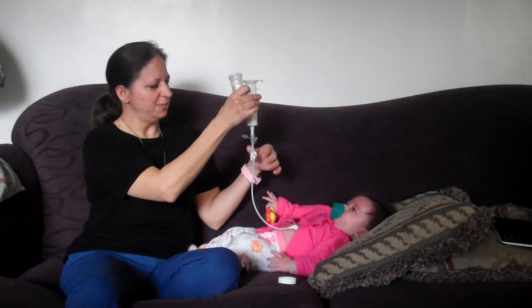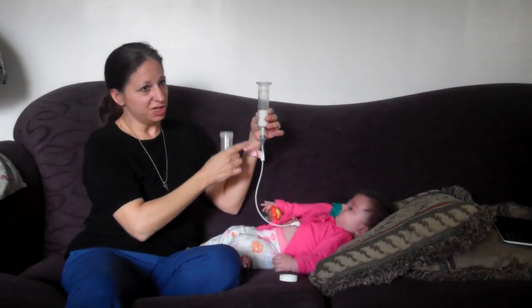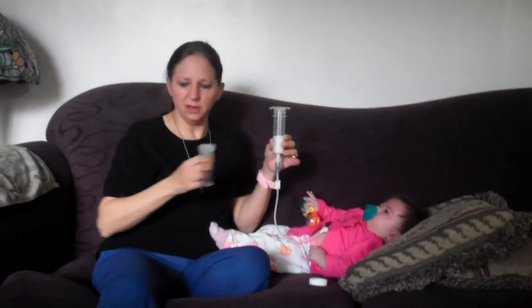See, now she's pushing it back up. She can push it all the way back to the top. So I'm going to clamp it for just a second.